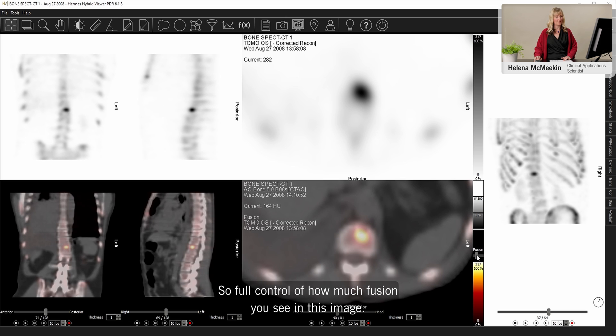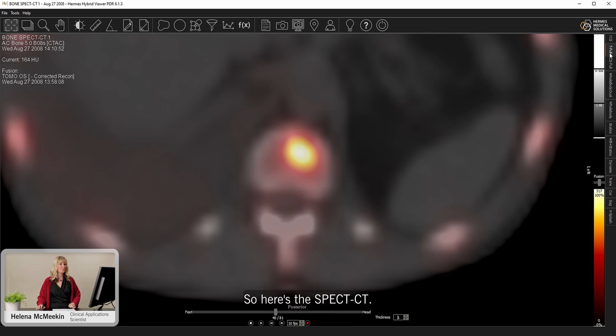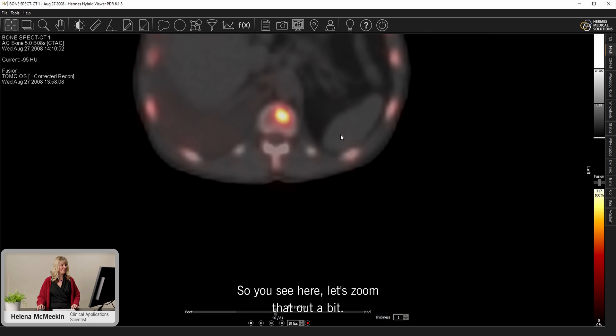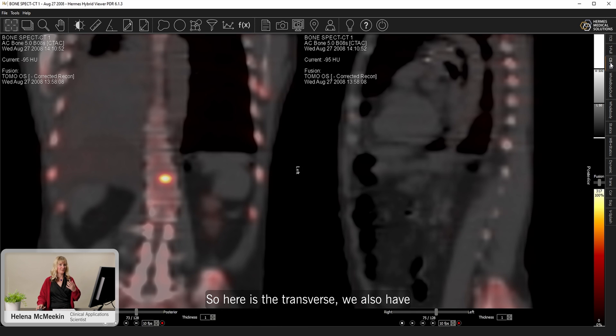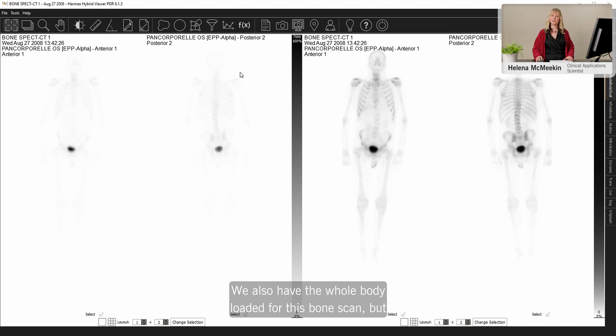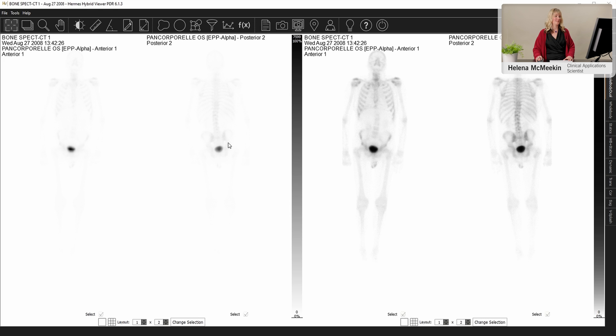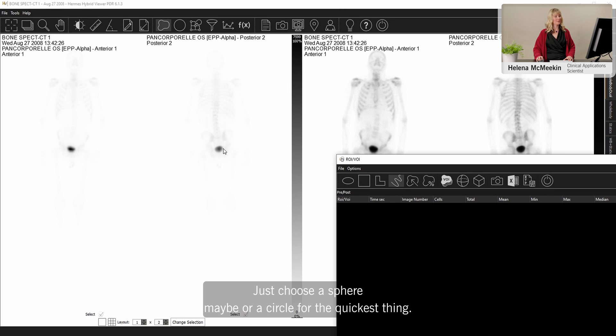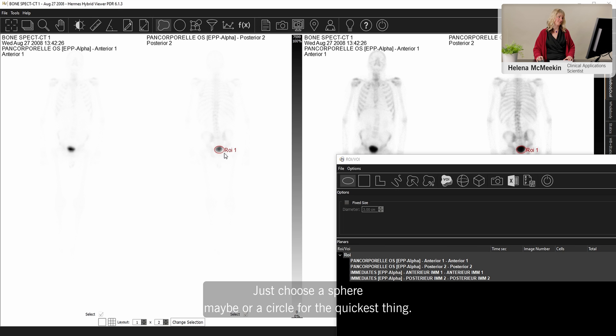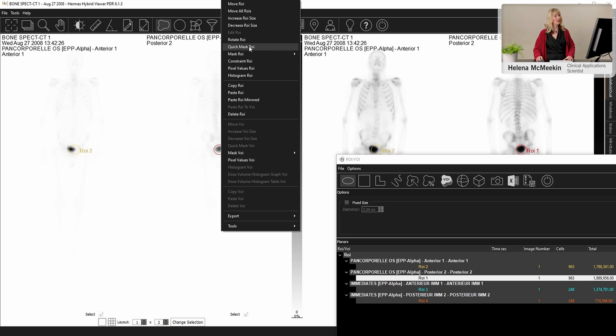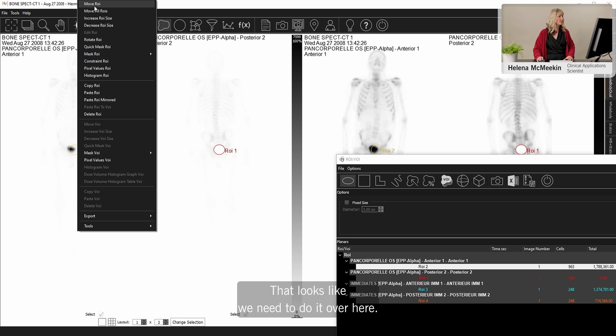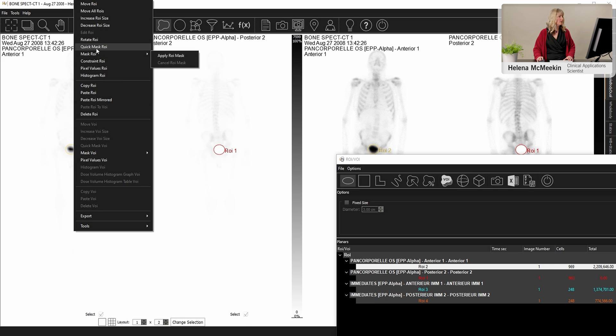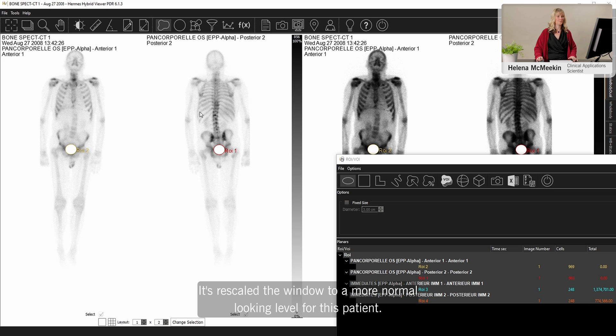So full control of how much fusion you see in this image. So here's the SPECT-CT. I've got different views of the SPECT-CT here. Zoom that out a bit. The transverse, we also have coronal and sagittal fused views presented. This is totally configurable to whatever you would like to see. We also have the whole bodies loaded for this bone scan. But we have the problem of a very full bladder in this case, in this patient. So the window level doesn't look good. But we can make a masking ROI very easily for that. So we can use our ROI tool. Just choose a sphere maybe or a circle for the quickest thing. Drag that out. Make a right click and choose quick mask ROI. And then it will rescale that. Looks like we need to do it over here. Let's just quickly nudge that over to this one. Make a mask. And there we go. It's rescaled the window to a more normal looking level.